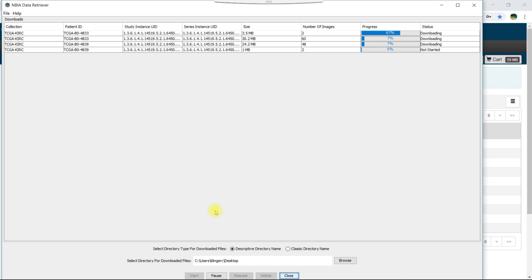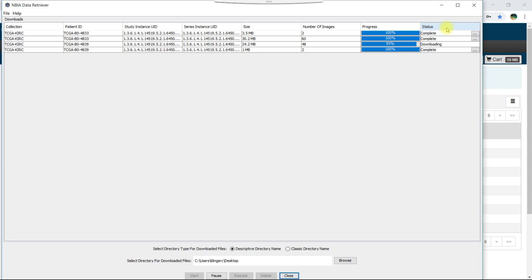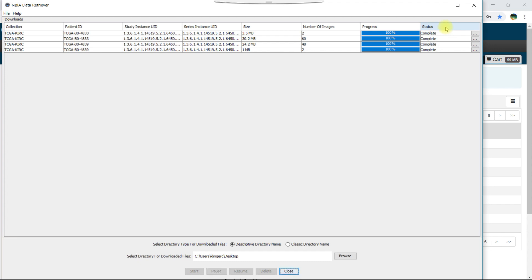You can click the pause and resume buttons at any time to temporarily stop and restart the download process. The status column indicates when the download of each item is complete. You can monitor the progress of the download in the progress column and find the data in the location you specified.